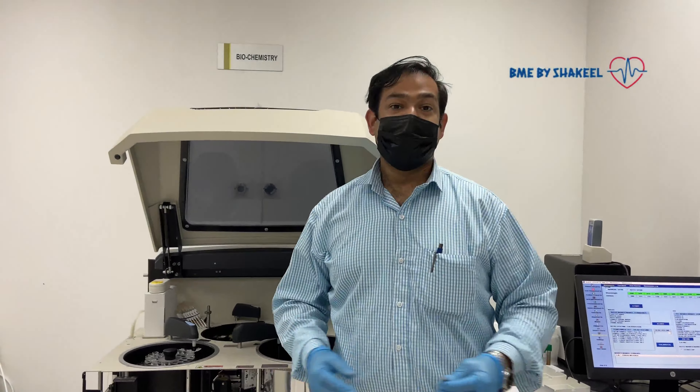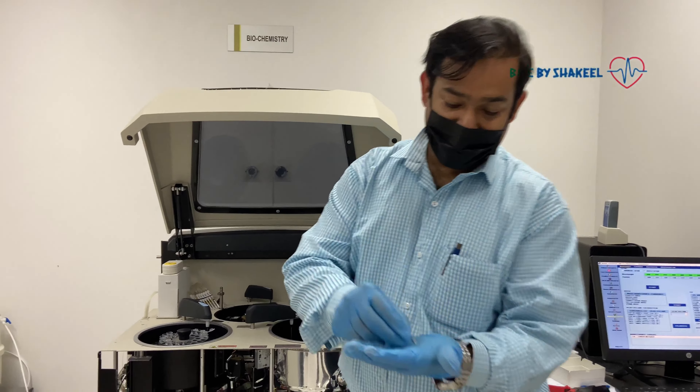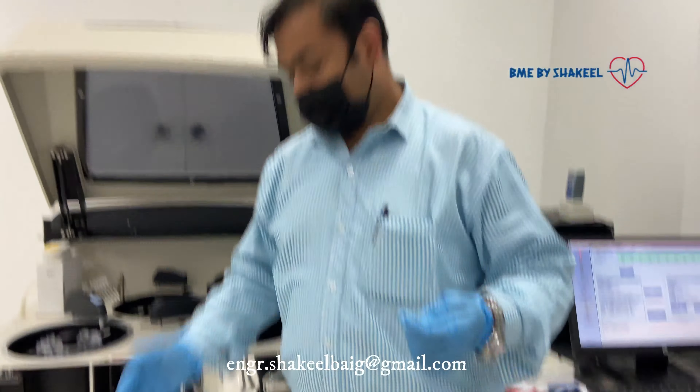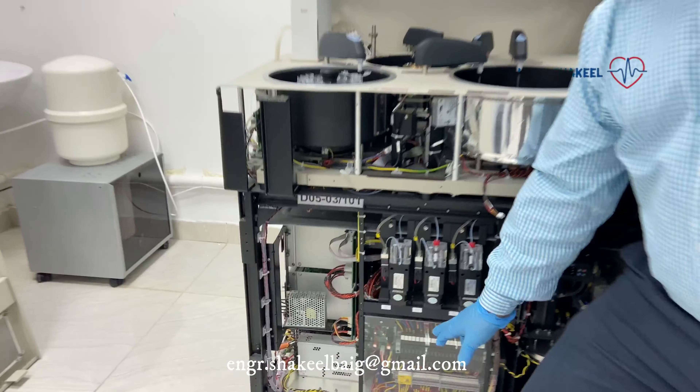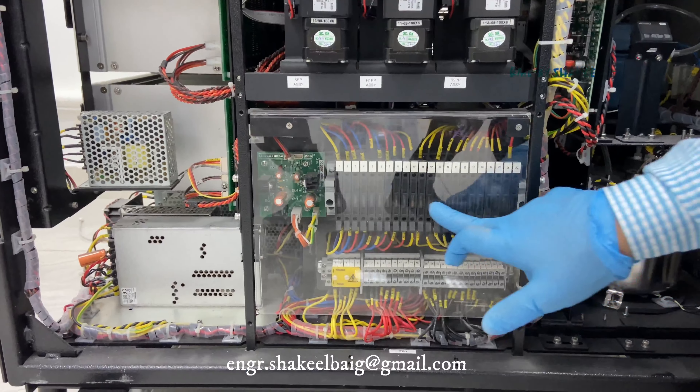We diagnosed the problem. You can see that these two fuses have blown out. You can see here — there are all the fuses from number one to twenty-two.